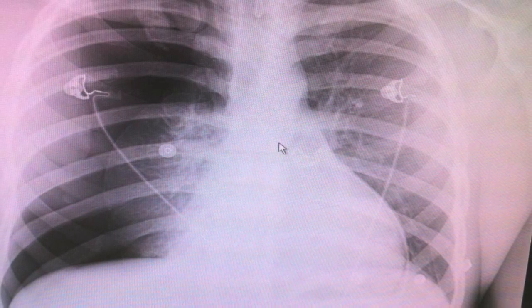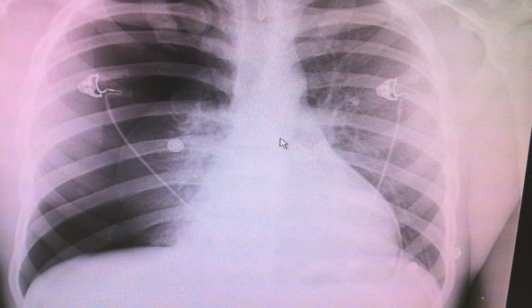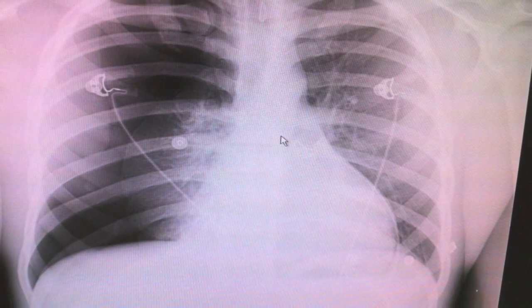Before you start doing any kind of procedure like this, number one, make sure you get consent. Number two, make sure you mark the side of the surgery. Wrong side surgery is a big deal — there are big monetary penalties, and it's not good for the patient. So make sure you print a copy of the x-ray, bring a copy to the bedside, and corroborate with the patient that the correct side is the right or the left. Mark it with a pen before you do anything else, and get your consent signed.